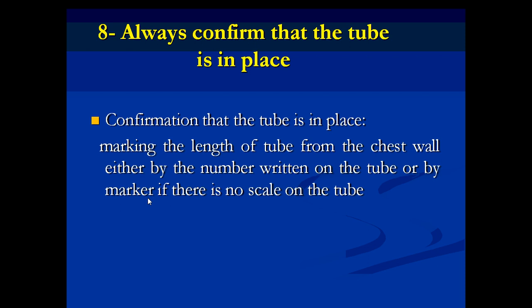Is it 15, or is it increasing or decreasing? Usually, if the chest tube has slipped outside, the 15 becomes 14, 13 or 12, it's decreasing. So a smaller distance of the chest tube is inside the patient's chest. So care should be taken so the last side hole will not come outside the chest wall.